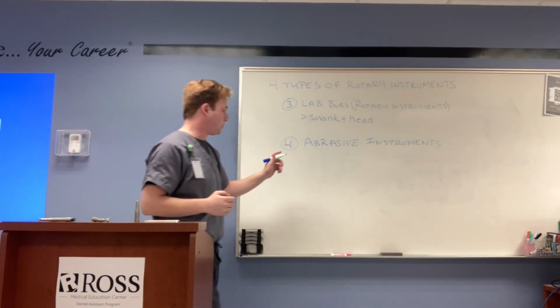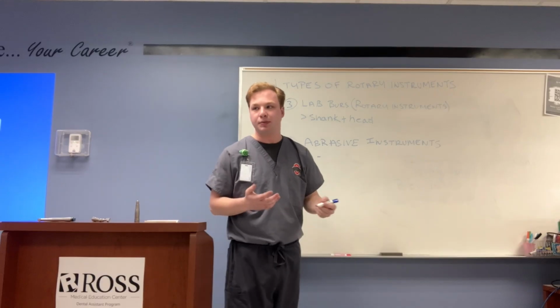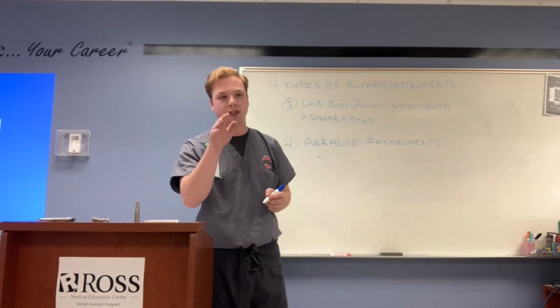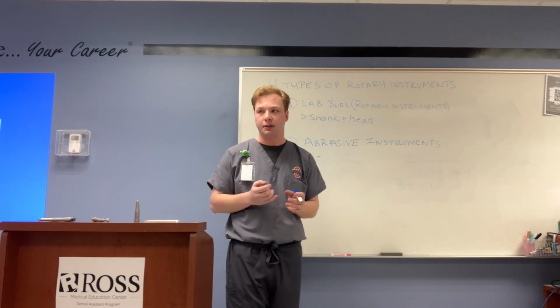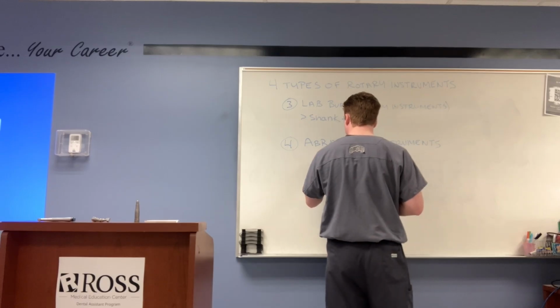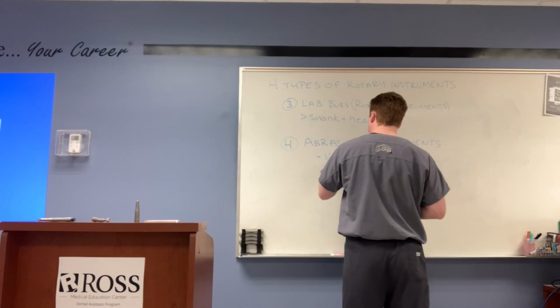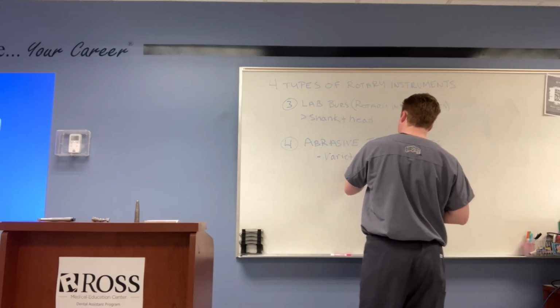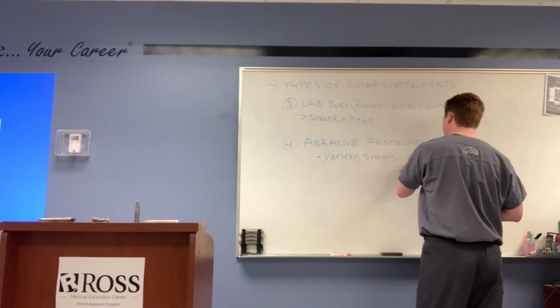So our abrasive instruments come in many different shapes and sizes. You might have these wheels, you might have points or cones or something like that. They have a variety of shapes, and they're usually flexible.